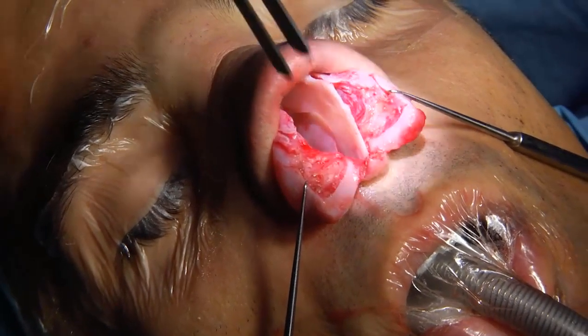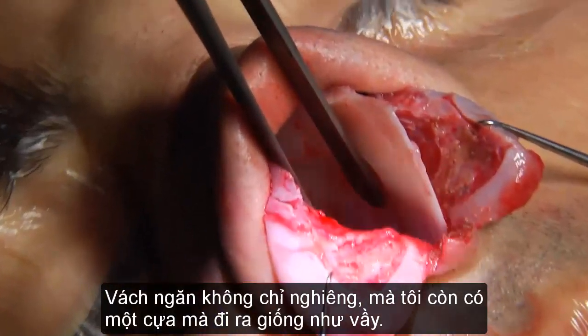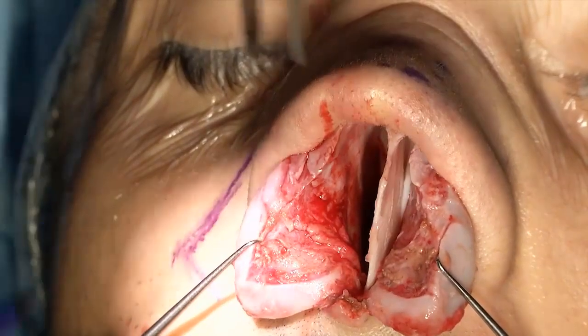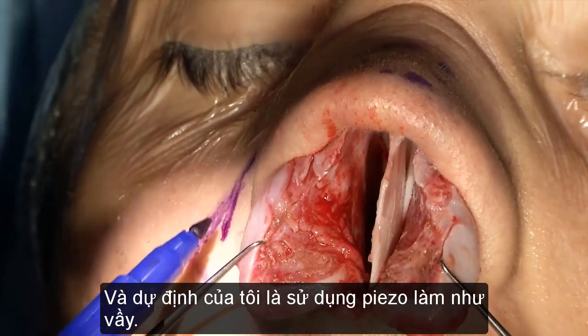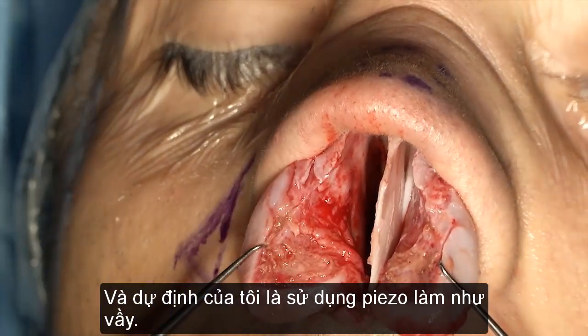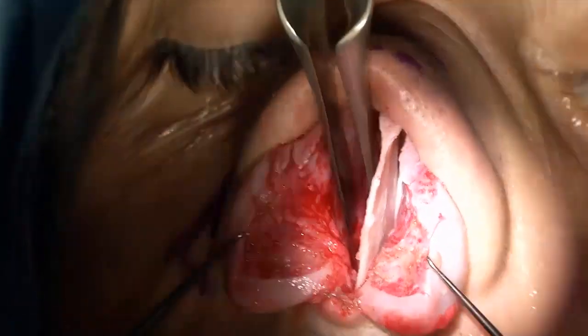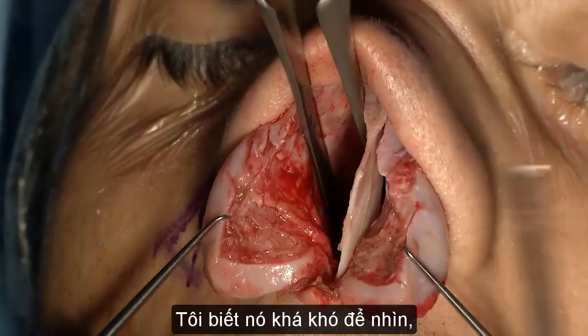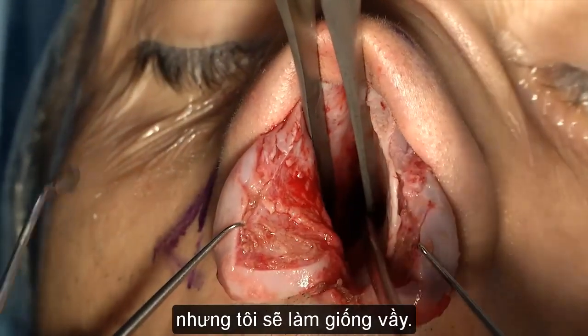So, as well as a septal tilt, I have a spur which comes like this. So my plan is to use the piezo in this fashion. And I know it's hard to see, but I will do this thing.